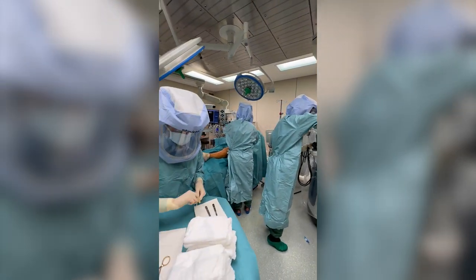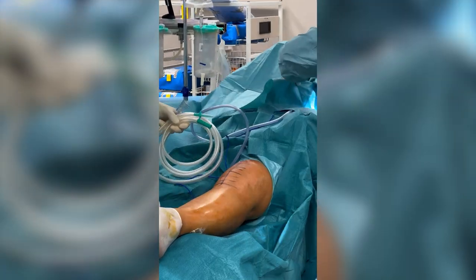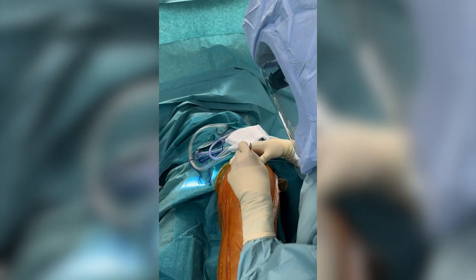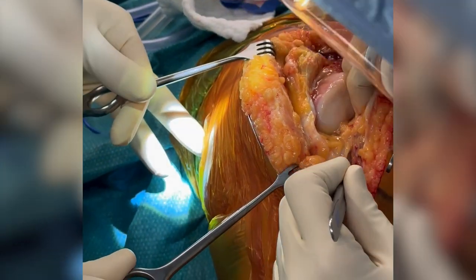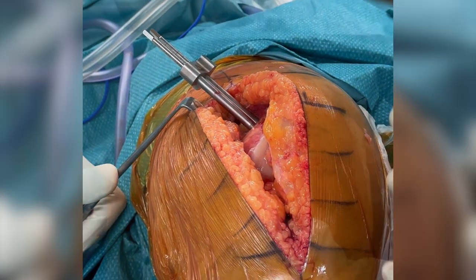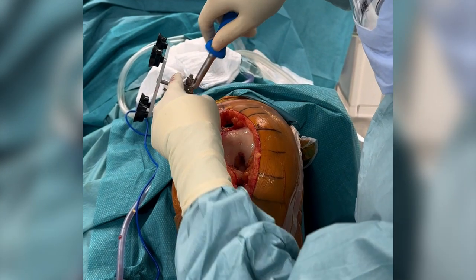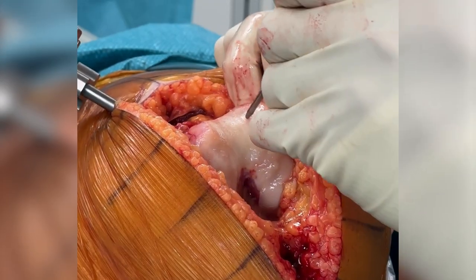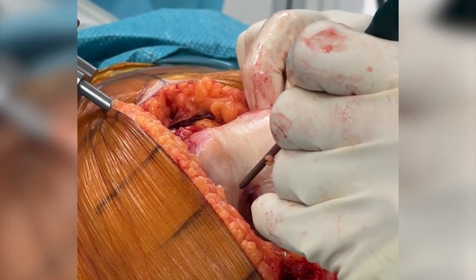In the OR now, this is our typical setup with the robot being installed, patient being draped, tourniquet applied, the leg is exsanguinated. Standard longitudinal incision, slightly medial to the midline, dissection deep to the subcutaneous layer and muscle-sparing mid-vastus opening of the knee. Drilling for insertion of the marker pins, and attachment of the reference frames so the robot can see where the knee and leg are in space. We make connection with the robot and the camera system, which connects with the reflective markers onto the pins. A mapping of the cartilage surface allows the robot to make the connection between the virtual and the real articular surface, so it knows precisely where it has to be.